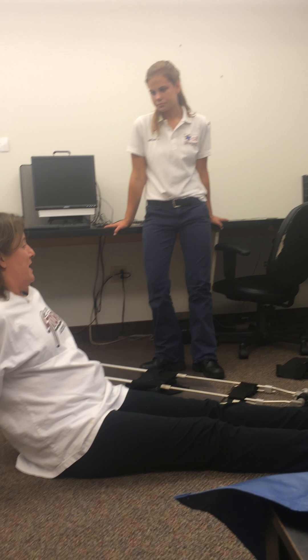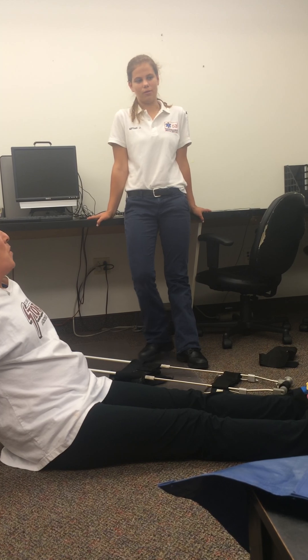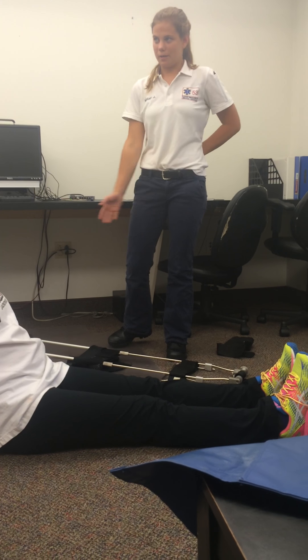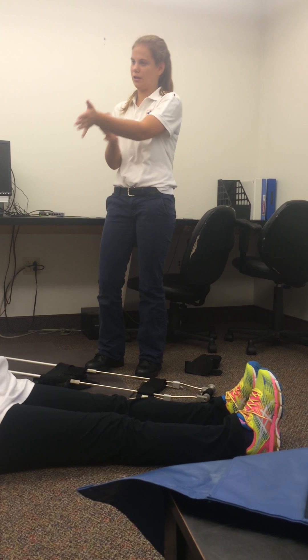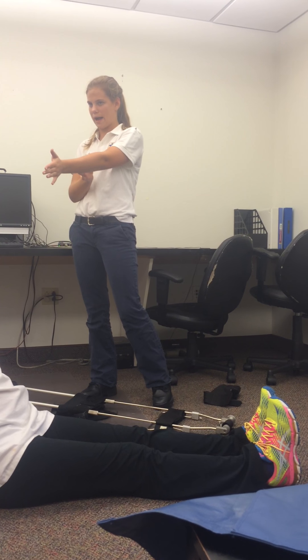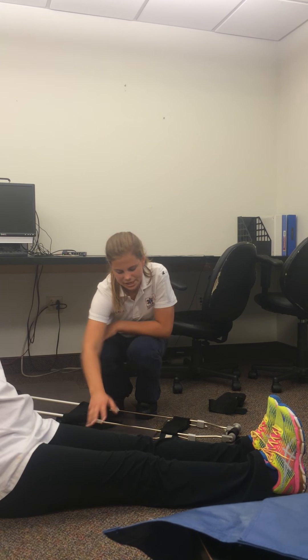They tend to be in a lot of pain — screaming in pain — because your femur is one of the hardest bones to break, so it's going to be really painful. This will stop the screaming and relieve that pressure. The job of this device is to realign those bones, because when the femur breaks the ends kind of shift, and this puts them back in line to relieve that pressure.